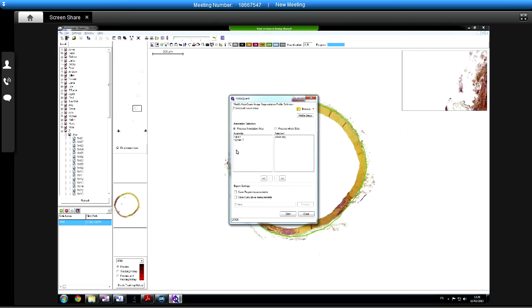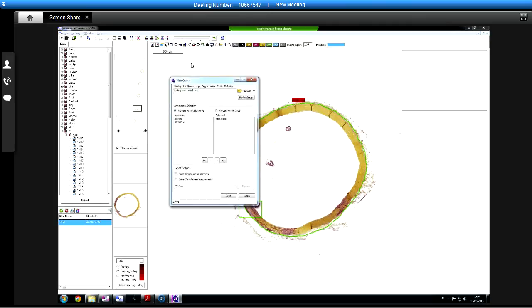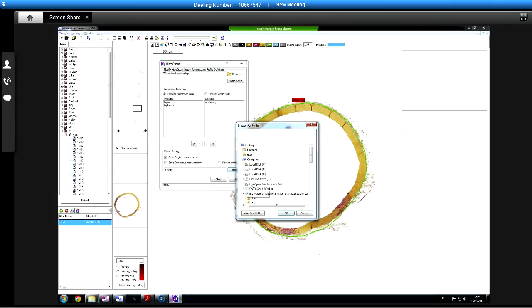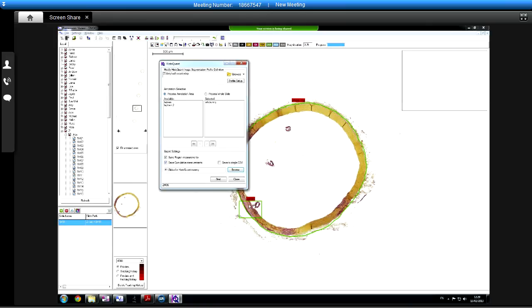I've never tried that. I'm not sure that would work. Yeah, maybe that would work. Yeah, we could try that. Especially if you did it on a yellow bit, you wouldn't care what it did in there, would you? Or one of those pinched in bits across them. I have a horrible feeling the whole ring's going to come up as marked.